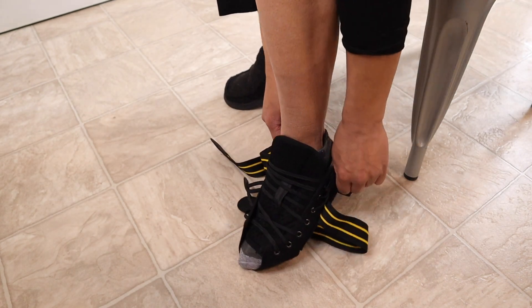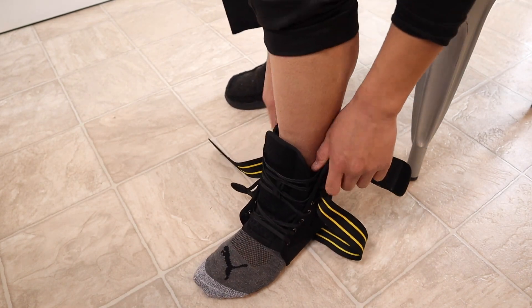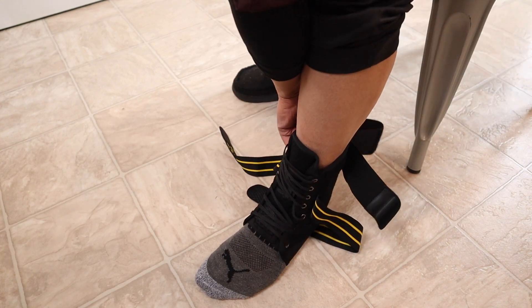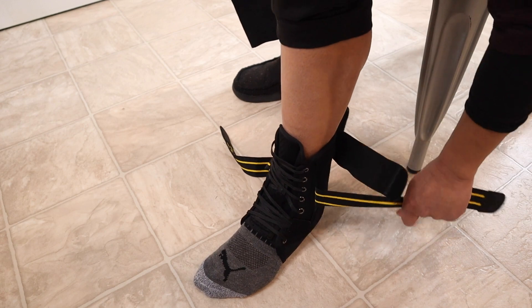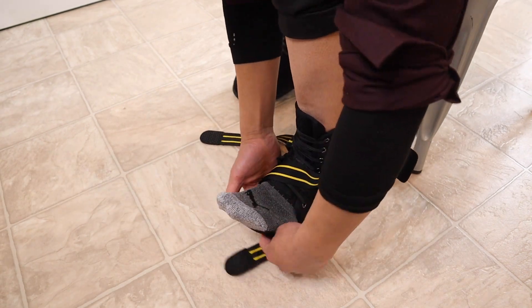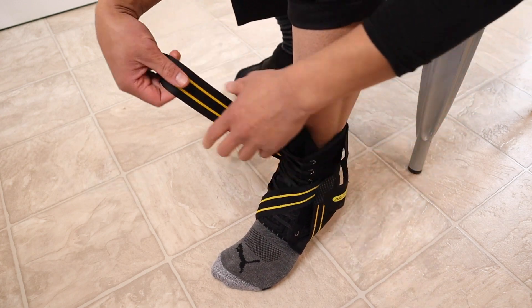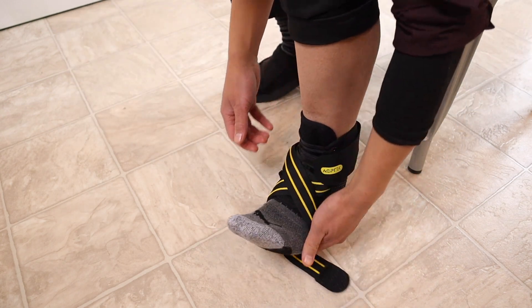Now you're going to slip your foot into the ankle brace. After your foot is in, adjust the tightness according to your personal needs, then wrap the right pressure belt from the instep to the sole of the foot, tighten it, and stick it on the side depending on what's comfortable for you.